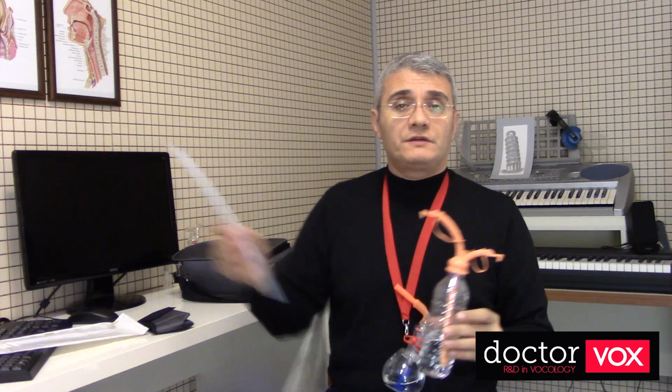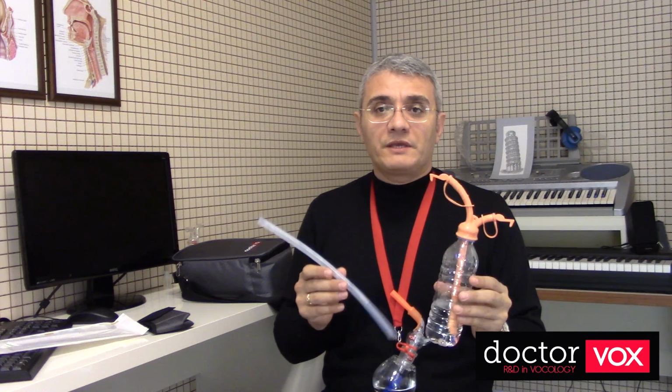So these 3 devices are the devices that you can use during the applications of Lax Vox voice therapy technique. Lax Vox voice therapy technique, which we call LVVT, is a direct technique which directly changes vocal mechanism. It is a holistic approach combining phonation, resonance, and breathing in voice therapy. Artificially elongated vocal tract and back pressure, which is continuous and alternative, are the main physical factors which intuitively balance the several simultaneous functions included in voice production. Various devices, Lax Vox tube, pocketVOX, or doctorVOX, provide multi-channel biofeedback and enhance treatment adherence in LVVT applications.